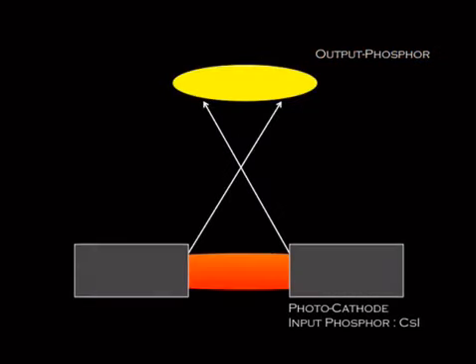Now let's compare that to the electronic mag. So if you decrease the input field of view, then you're also going to be decreasing how much actually comes out. Now this is going to result in a brightness decrease because you've reduced the amount that's actually coming through here.